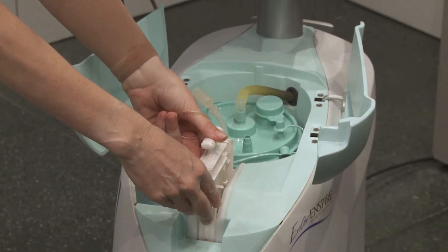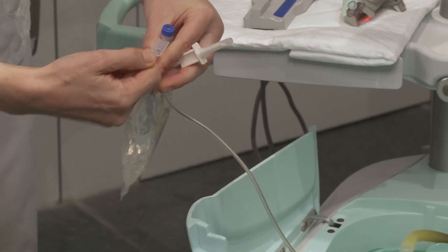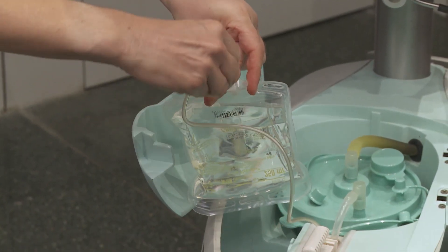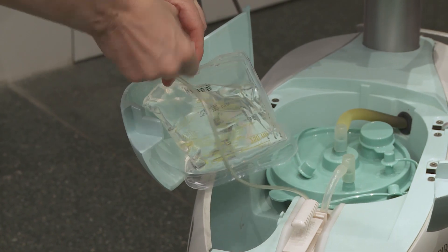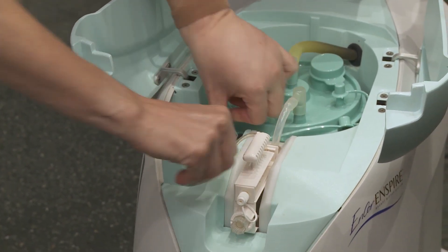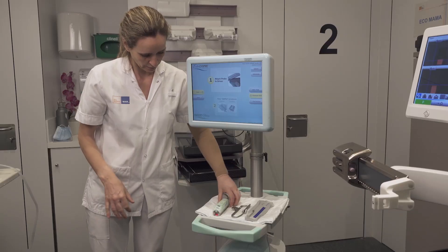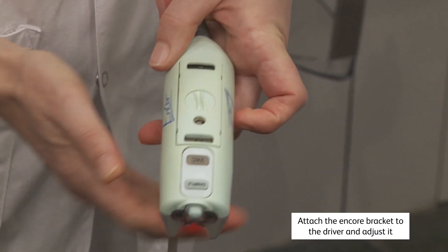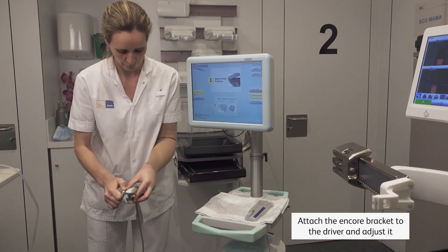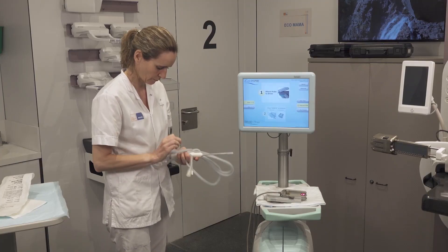Insert the cassette. Connect the large tubing of the cassette to the empty port on the canister. Connect the saline cassette tubing to the saline recipient and place it in its dedicated slot. Close the covers.